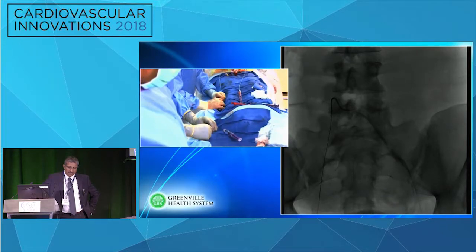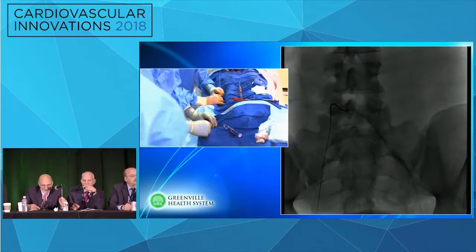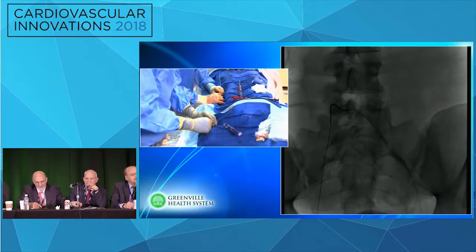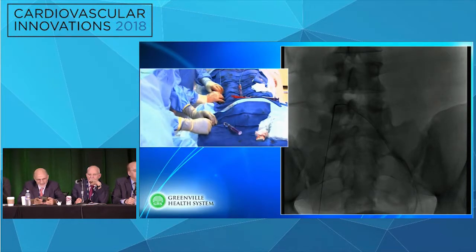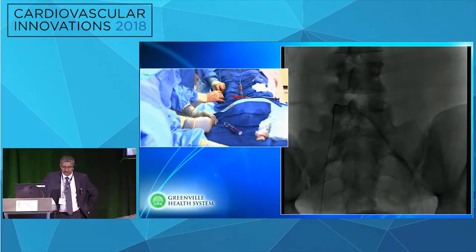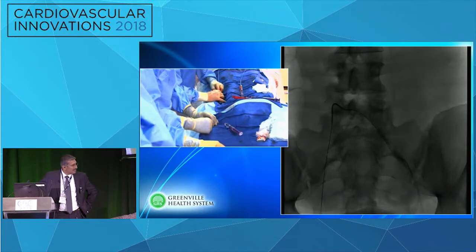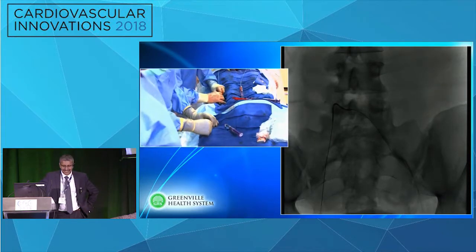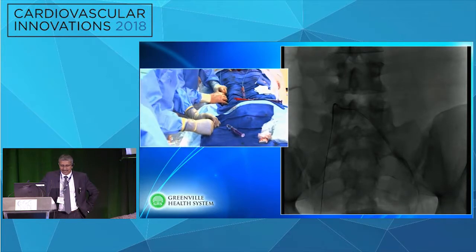If you pull back on that catheter, it'll probably give you a little more support. Just a quick cross. There, now he's pulling down. Not too much. Yeah, now's when you want that Simmons, huh? Yeah, that's true. That feels like it should.